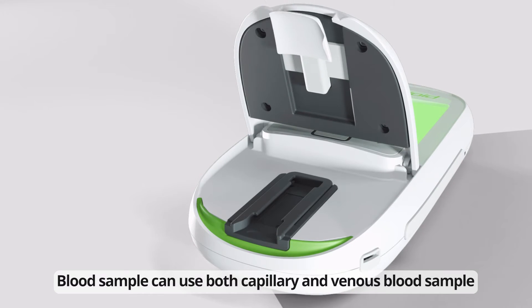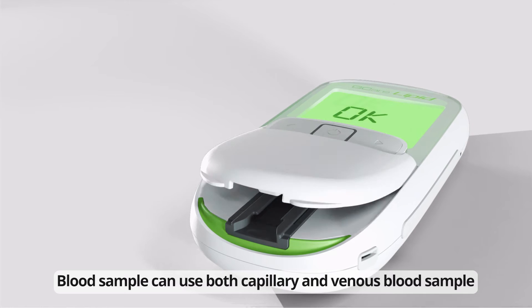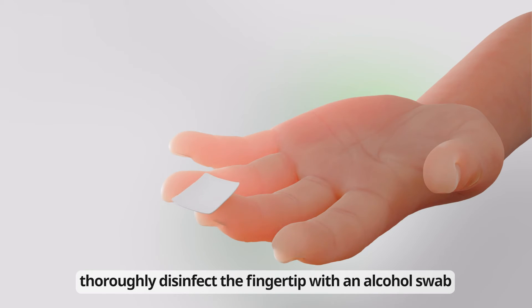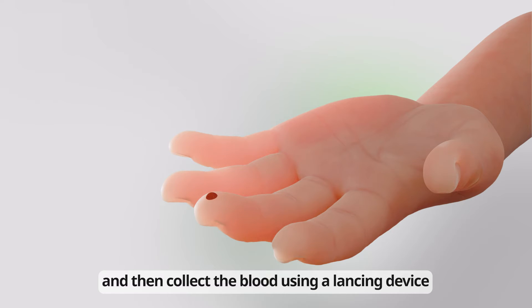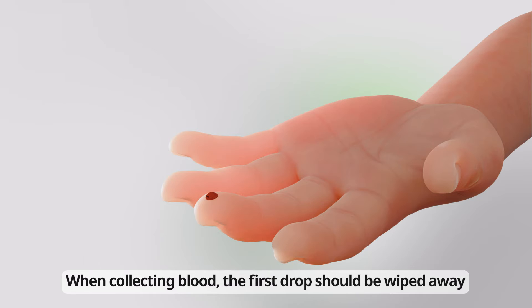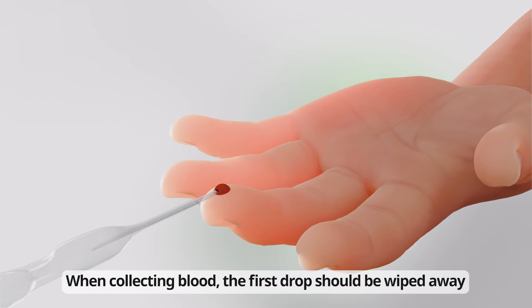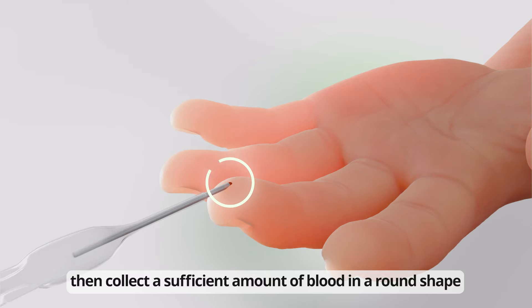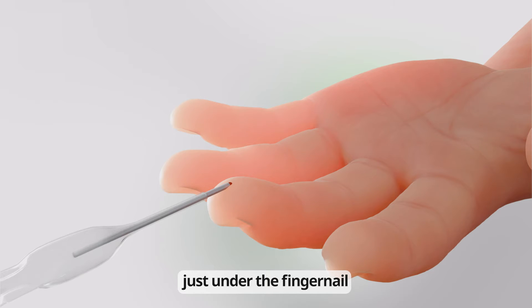Blood samples can use both capillary and venous blood. Before collecting the blood sample, thoroughly disinfect the fingertip with an alcohol swab and then collect the blood using a Lancing Device. When collecting blood, the first drop should be wiped away. Then collect a sufficient amount of blood in a round shape just under the fingernail.